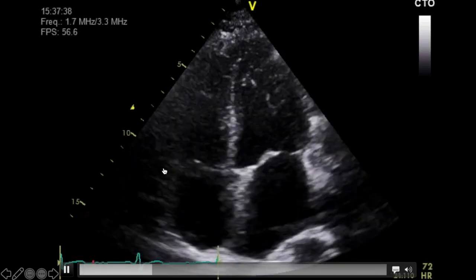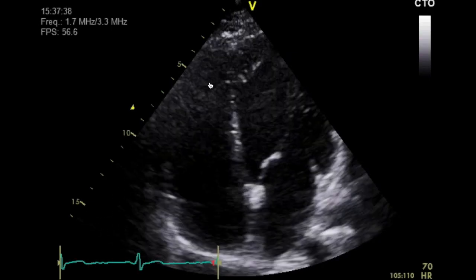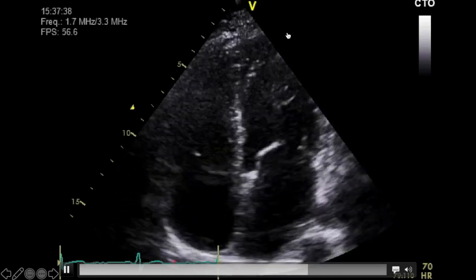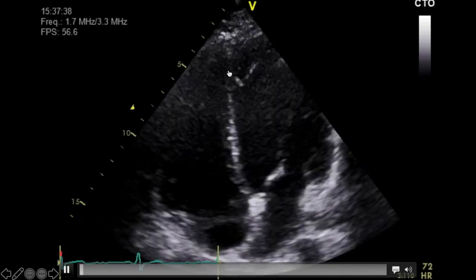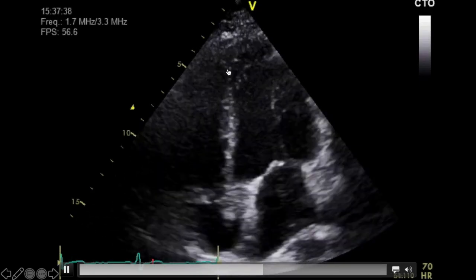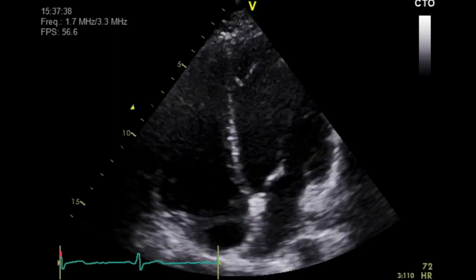But the idea is that you look at how the right ventricle appears next to the left. It's important that you make every effort to get a good image and make sure you haven't foreshortened the heart, so as not to falsely identify that the right ventricle is forming part of the cardiac apex, which of course in health it doesn't. So if you foreshorten the heart though, it may appear that this is the case.